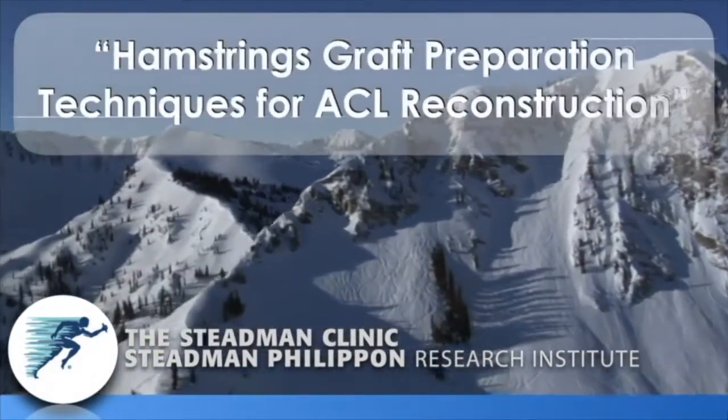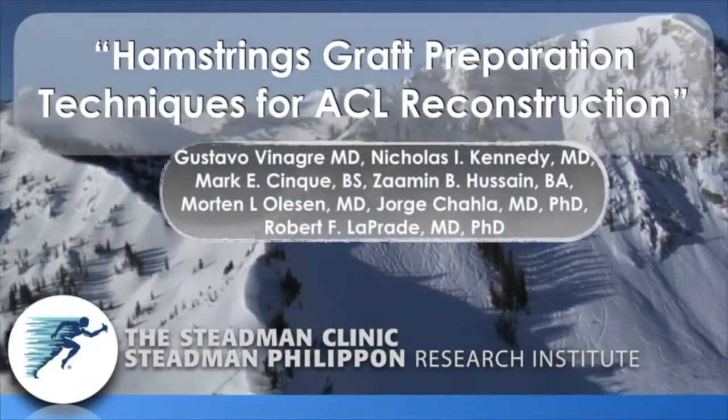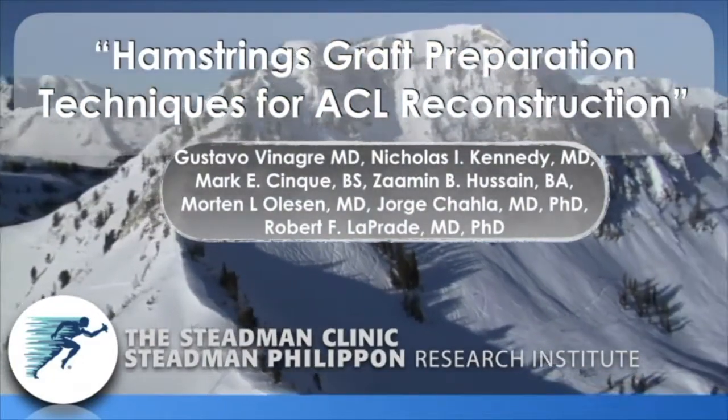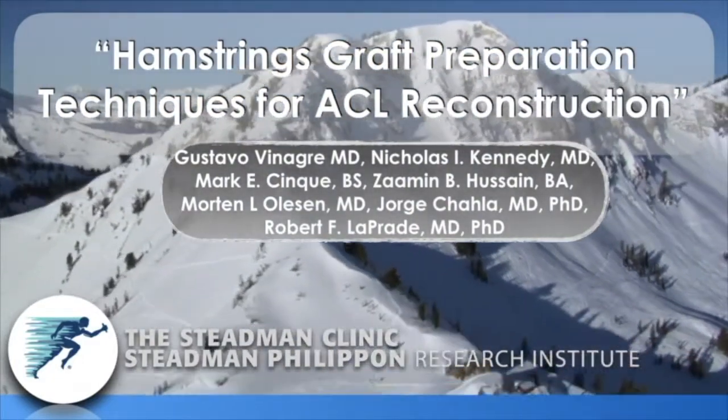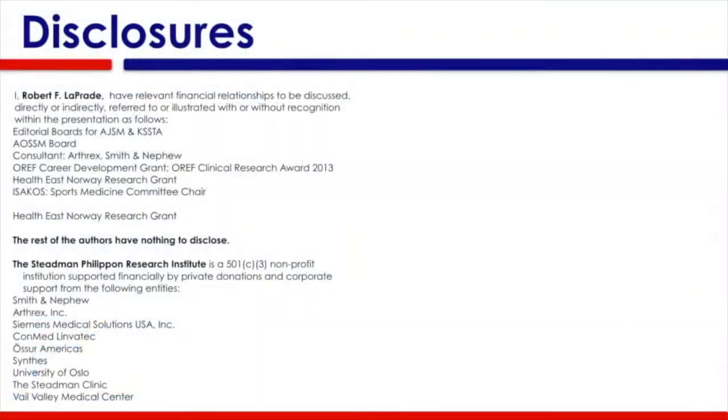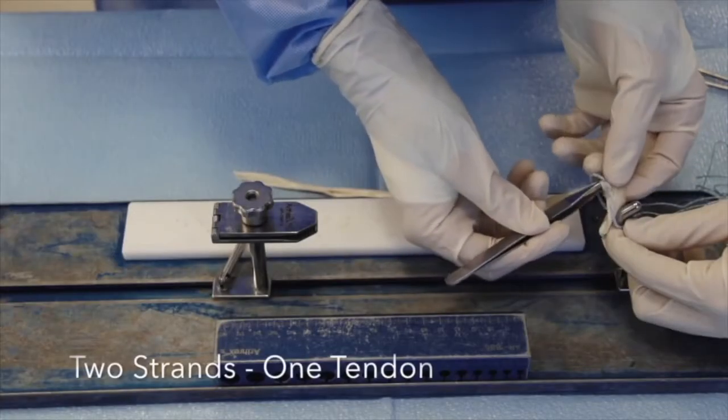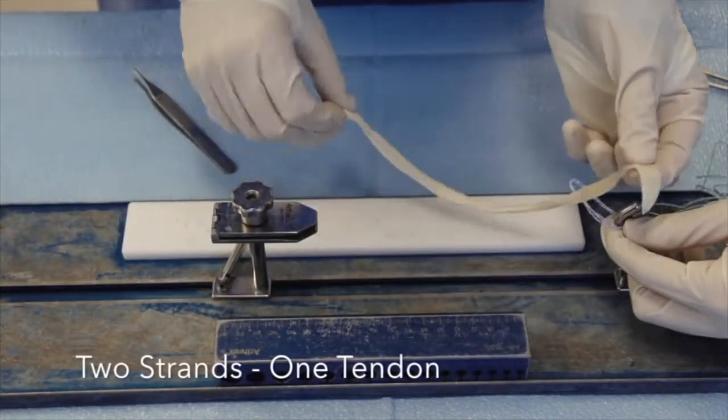This surgical technique video will demonstrate hamstring graft preparation techniques for ACL reconstruction. We will first demonstrate the double strand technique with one tendon.